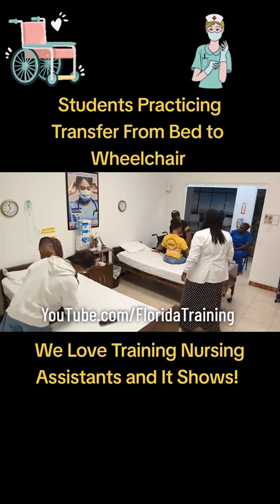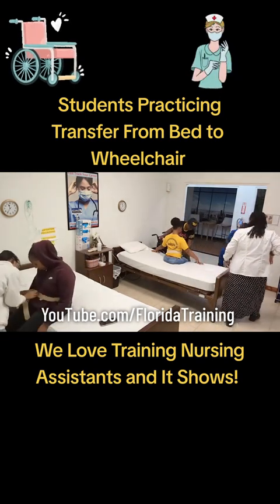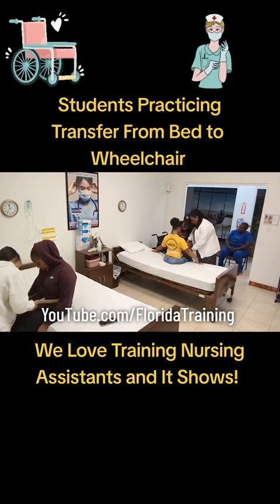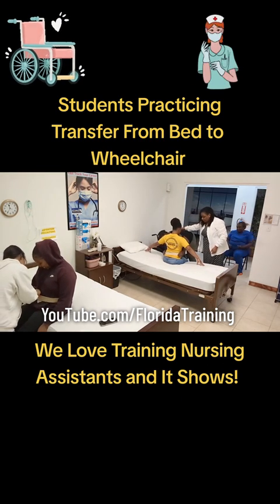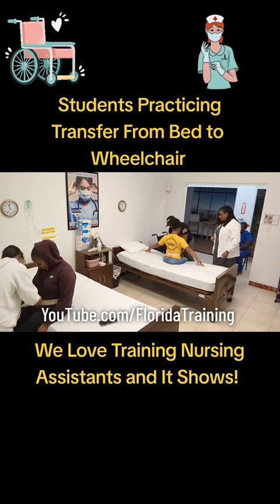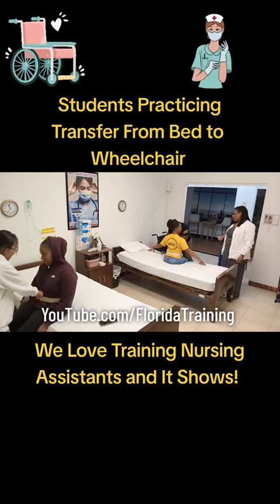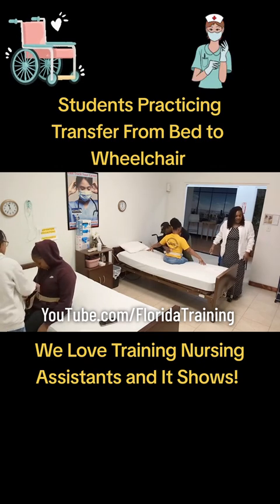Now, my CNA who's putting the belt on — it's shifted. She doesn't like how it feels. Put your hands here, look around, keep that belt low. Can you see around? You want to look around. You can't make it tight once you have it secured. She says it's tight enough.